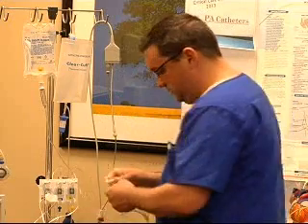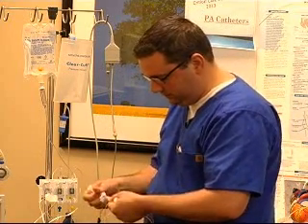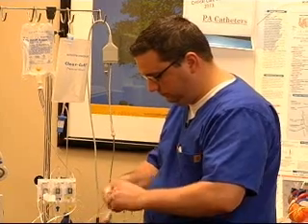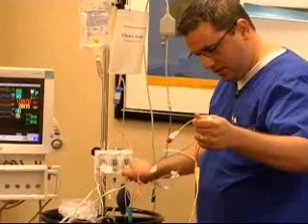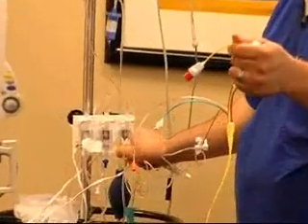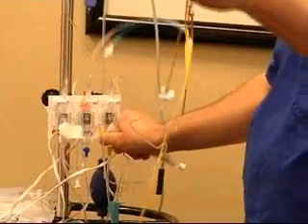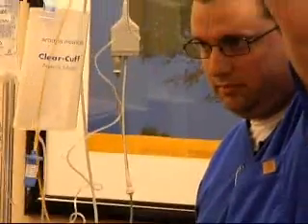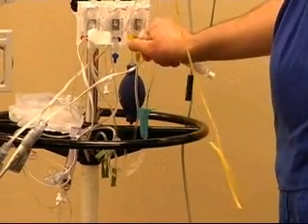And just to show you an example here, I'm going to connect the PA line. Now, if you're not getting any flow through this, it would be okay to go ahead and pump up your bag a little bit and force the rest of that through. You can see that coming out the distal tip now. You can see the water dripping out the tip. And so your system's primed.